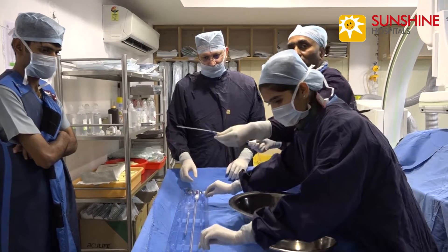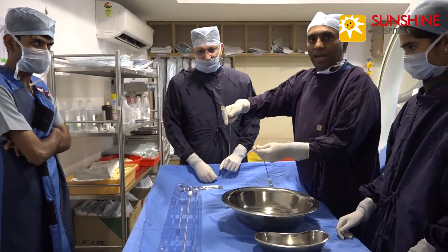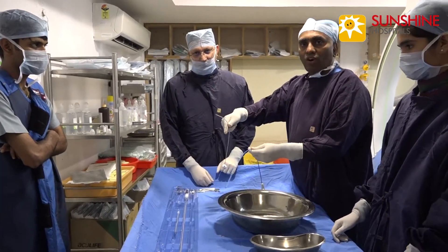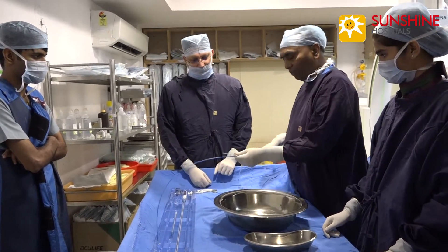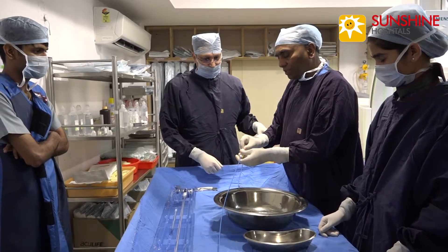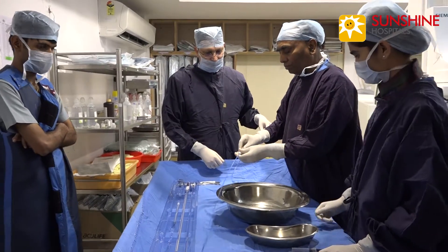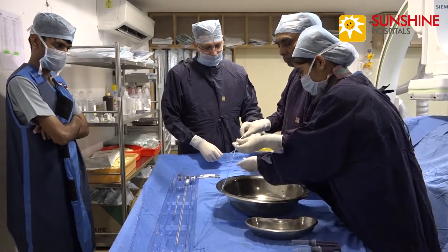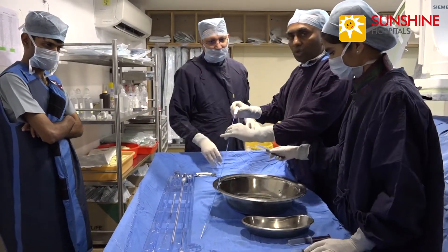This is the seven French sheath. This is the dilator with the angiographic catheter. Now we are inserting the dilator into the sheath. Now we have locked it.